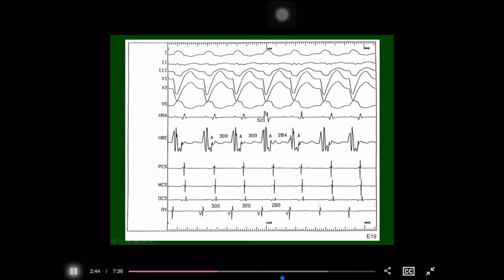So if we put a PAC in at the same time or just after that local A is activated, we can't be going down the AV node with that complex. We must be going down something else. And it's not VT because otherwise the PAC wouldn't bring it in. So we know we're going over an accessory pathway.